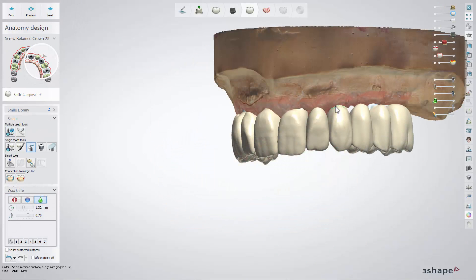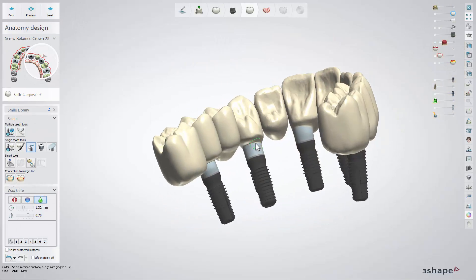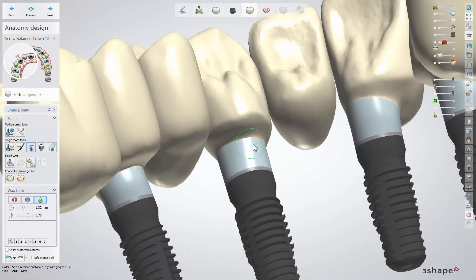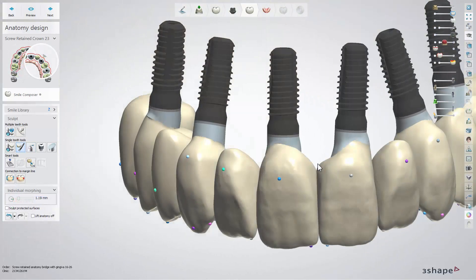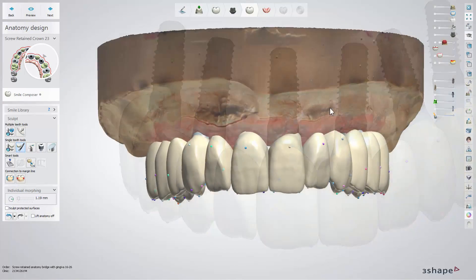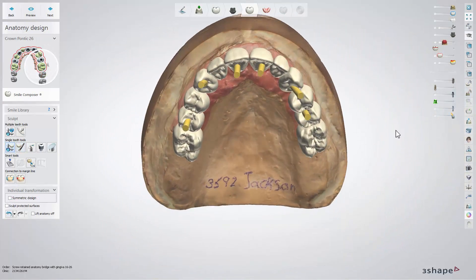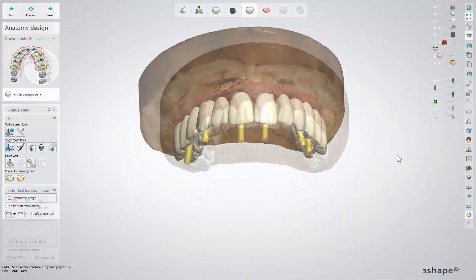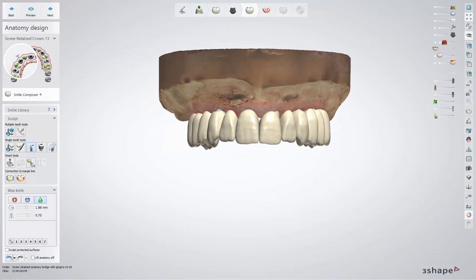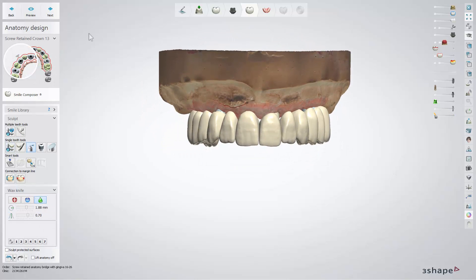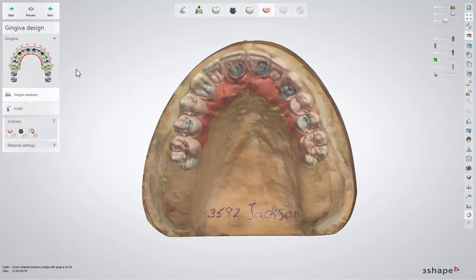Now you have the teeth anatomy back and you can work on them, adjusting the shape, contact points, and occlusion. For this, you can use the available tools in the Sculpt Toolkit. When done, click next to get to the Gingiva design step.